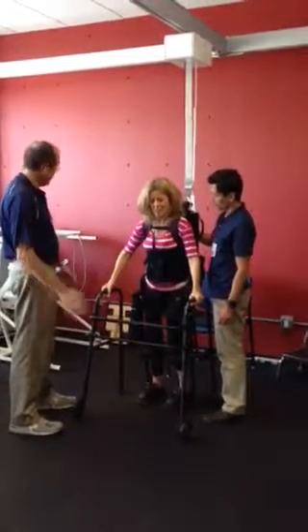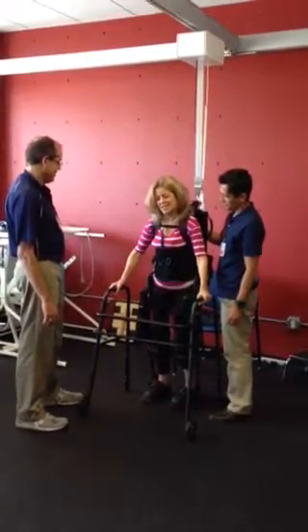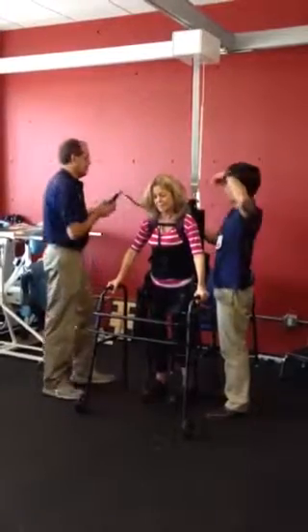You don't take this step — we do that. Not in the flack. Good. Great.